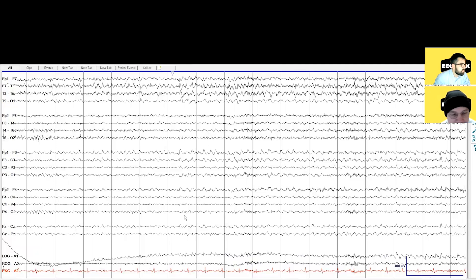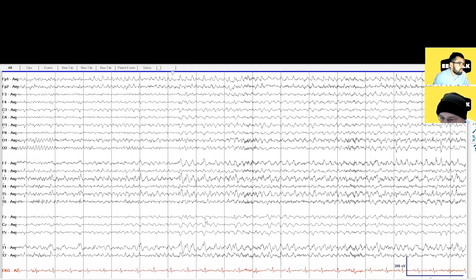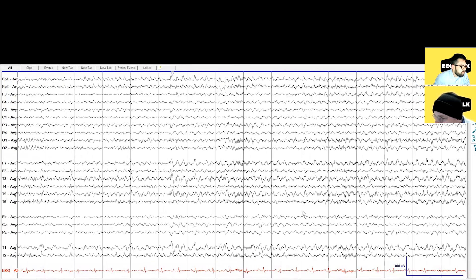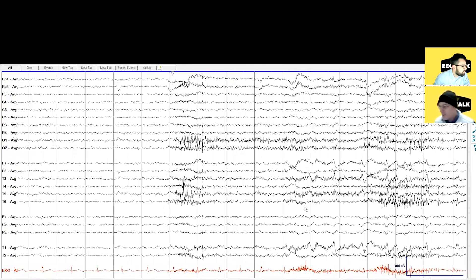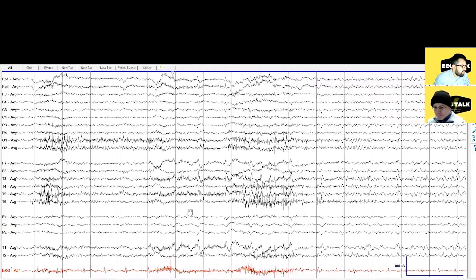I should have switched to average. Let's take a look. It's even clearer. I see more at T3. Let's go back to the beginning of the seizure to be more accurate. Now look at this — switching to average, before it started there are actually some spikes. This starts in the left anterior temporal region. Classic.